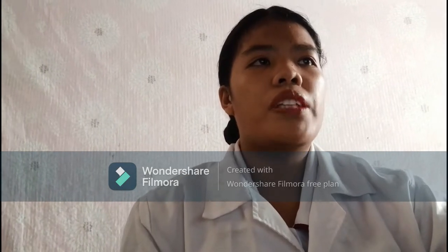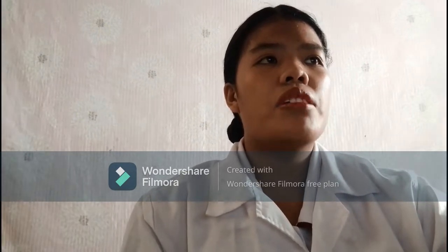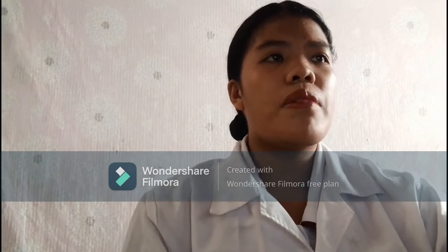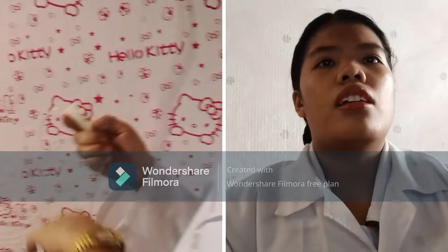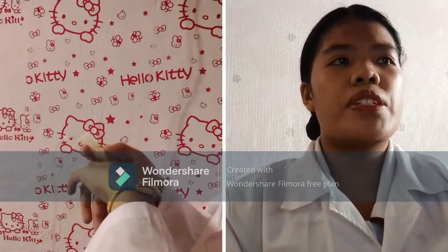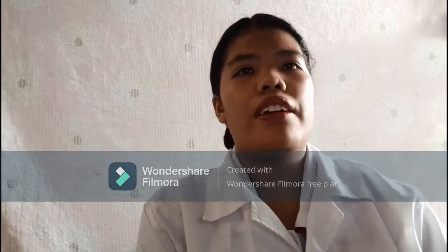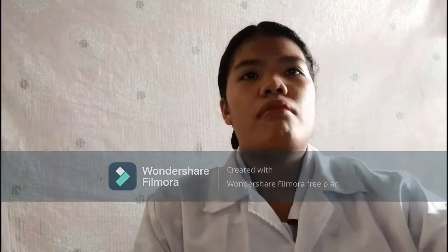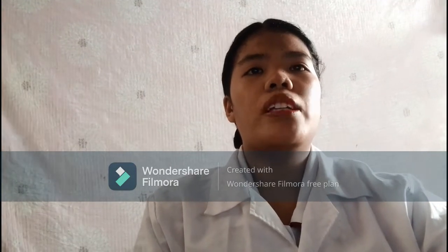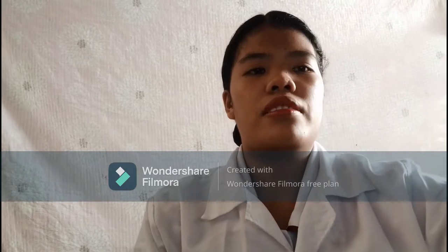An arm board protects against change in the position of the vein and acts as a reminder to the client to minimize arm movements. Adjust the rate of flow according to the doctor's order. The physician prescribes the rate of flow. Label and tape to the IVF bag or bottle. After care of the equipment and wash your hands. This deters the spread of microorganisms.